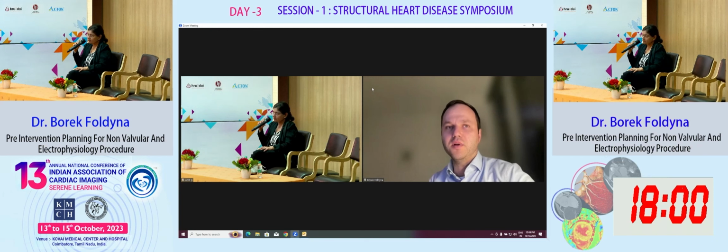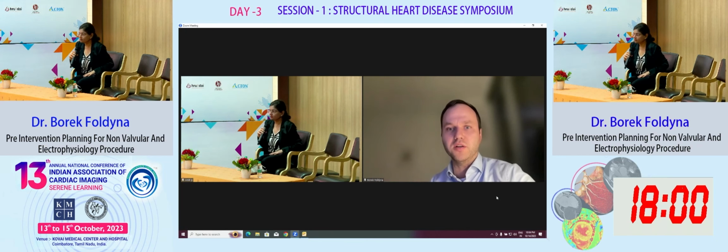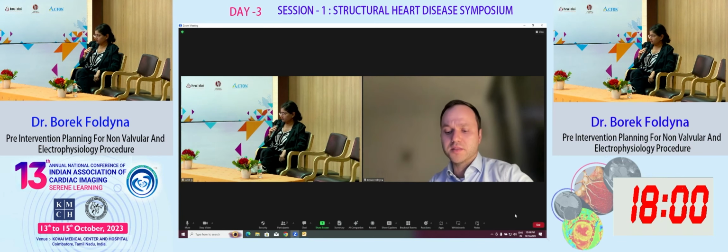And I know that the EP lab, I'm a radiologist, I don't do these procedures, but in these cases they use this LAVA procedure where they ablate a large area of the myocardium. And if the scar, or the border zone, is primarily epicardial, then sometimes they do even an epicardial ablation as well. And are you also calculating the extent of scarring in the LA?